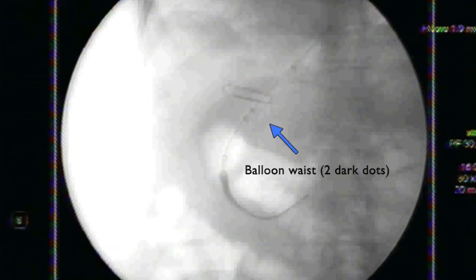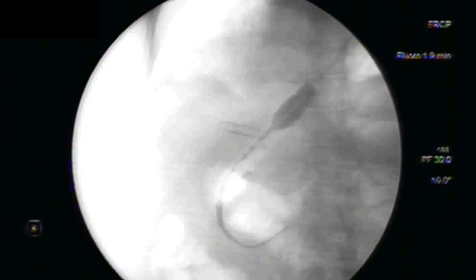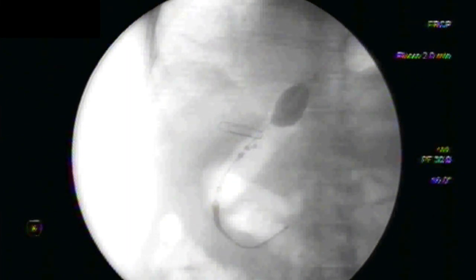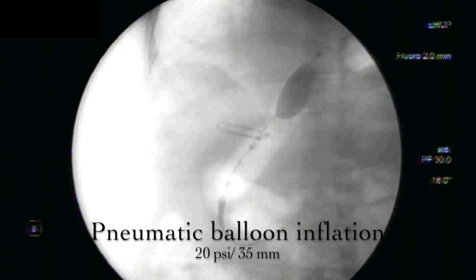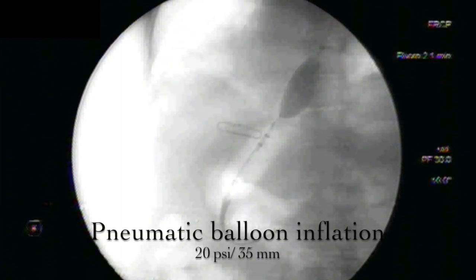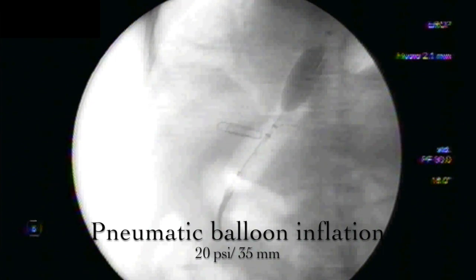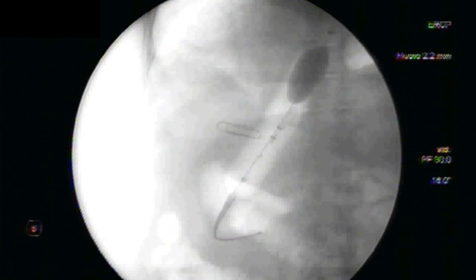On fluoroscopy, the waist of the balloon is marked by the two closely spaced black dots. After correct positioning of the balloon waist at the gastroesophageal junction, the pneumatic balloon is slowly inflated to a pressure of 20 psi, and minor adjustments are made during the inflation process to prevent proximal or distal migration of the balloon.